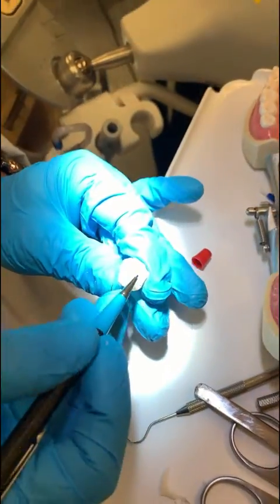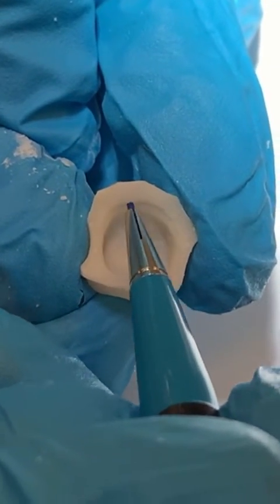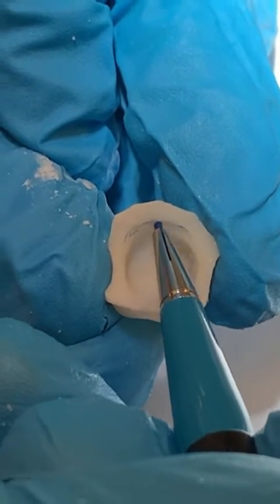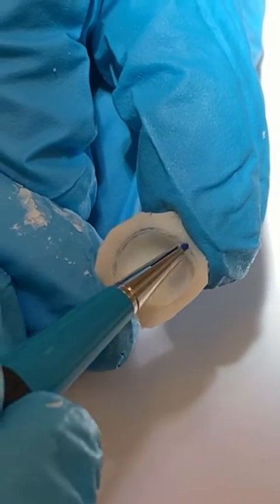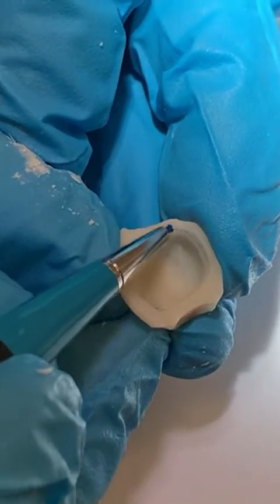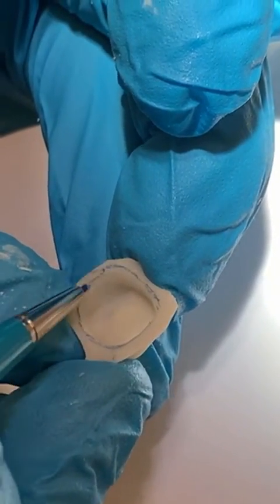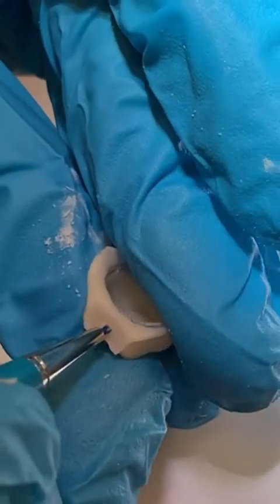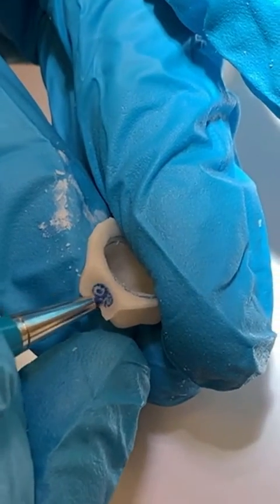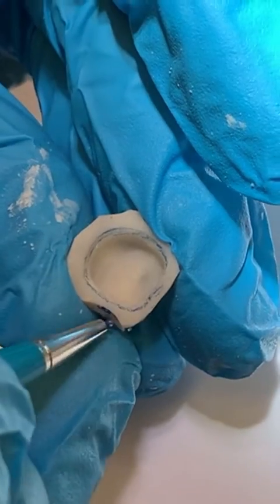What I have to do here is read the margin. We're going to mark the margin — you're going to find the margin there and read it. You want to be safe and keep yourself away from the real margin. I'm also going to put a mark on the contact — the mark means I should not touch that. Now I'm going to use a disc to trim this away. Stop right there; now when we have it marked, we're going to go ahead and trim away.